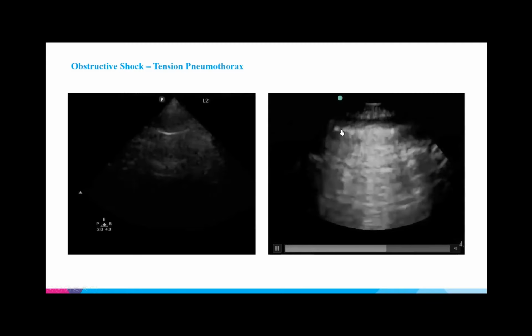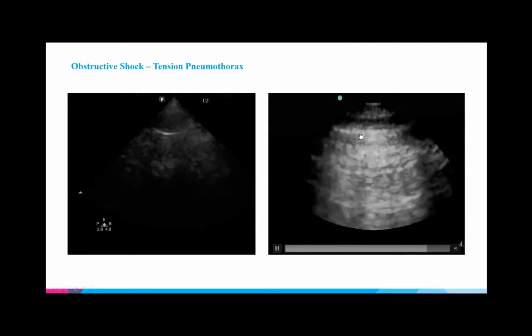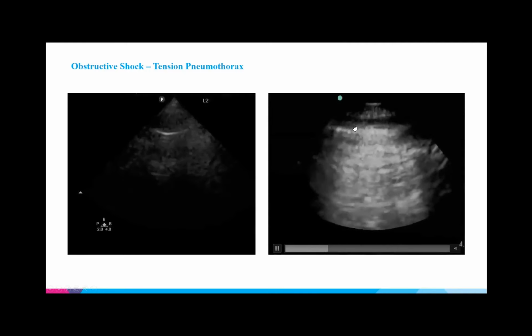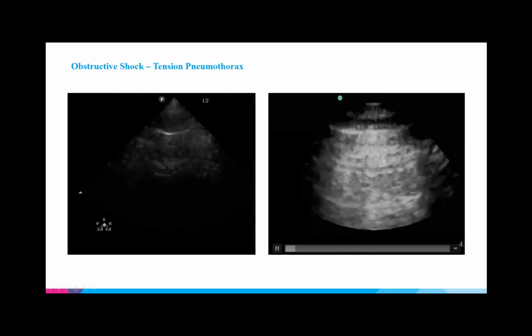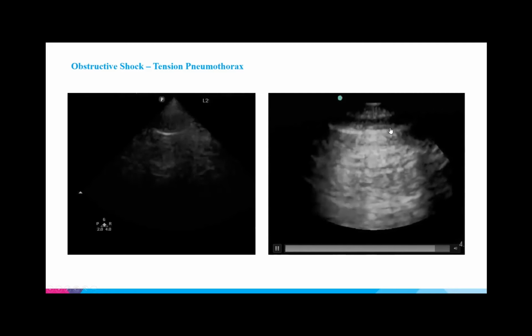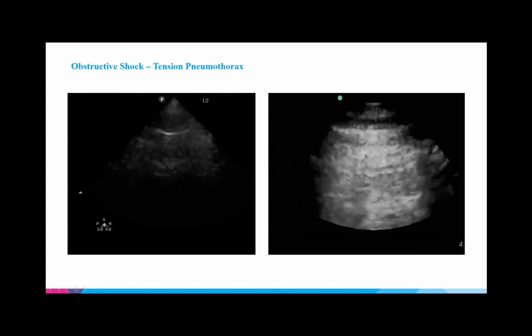So this actually represents the border of a pneumothorax, where above it in this case, because this is depending on whether they were holding the probe correctly, there's normal lung sliding with the movement of the pleura, whereas right here, there's an absence of lung sliding with no movement of the pleura. So this would serve as your border and would indicate where we may want to put the chest tube. Obviously, you want to put it in the area where there is no lung sliding. You don't want to damage any lung that's functioning. So definitely if you see any of these, let the critical care team know.